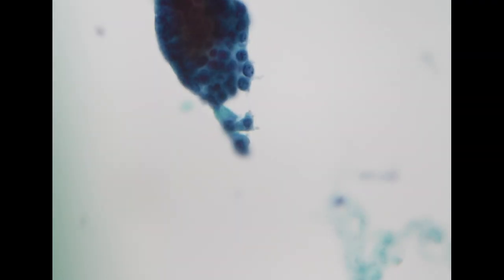However, for this cluster, we didn't see very prominent nucleoli. We only see enlarged nuclei of the cells in a cluster with glandular shape. Here is a cell with a more eccentric nucleus and a little bit of vacuole in the cytoplasm. However, the overall feature, I would say, is only suspicious for adenocarcinoma, but not definite.